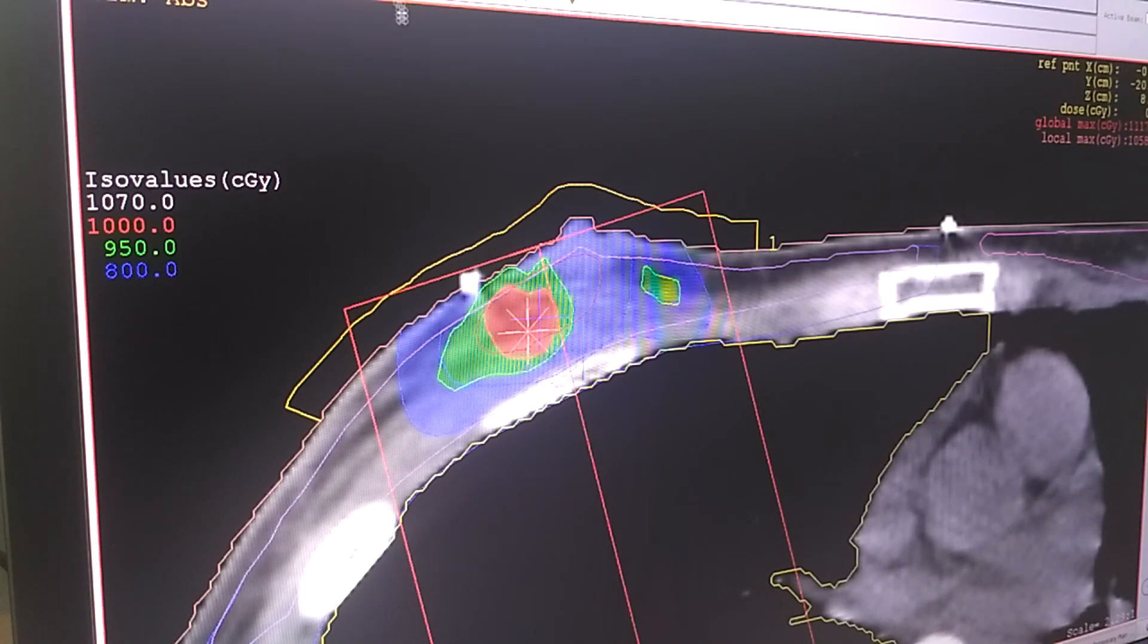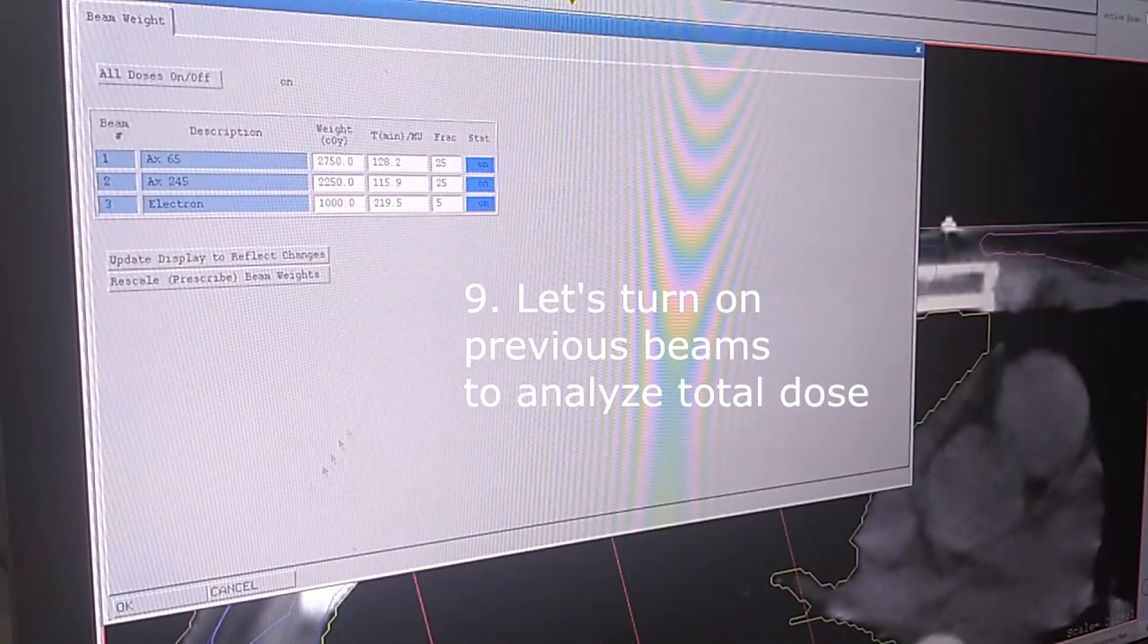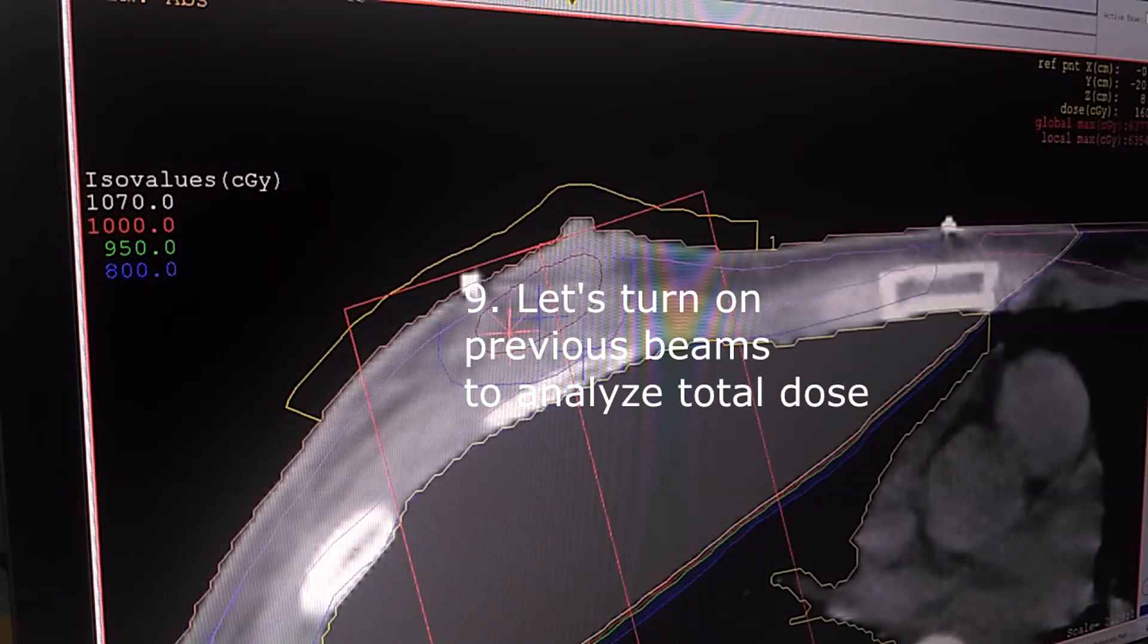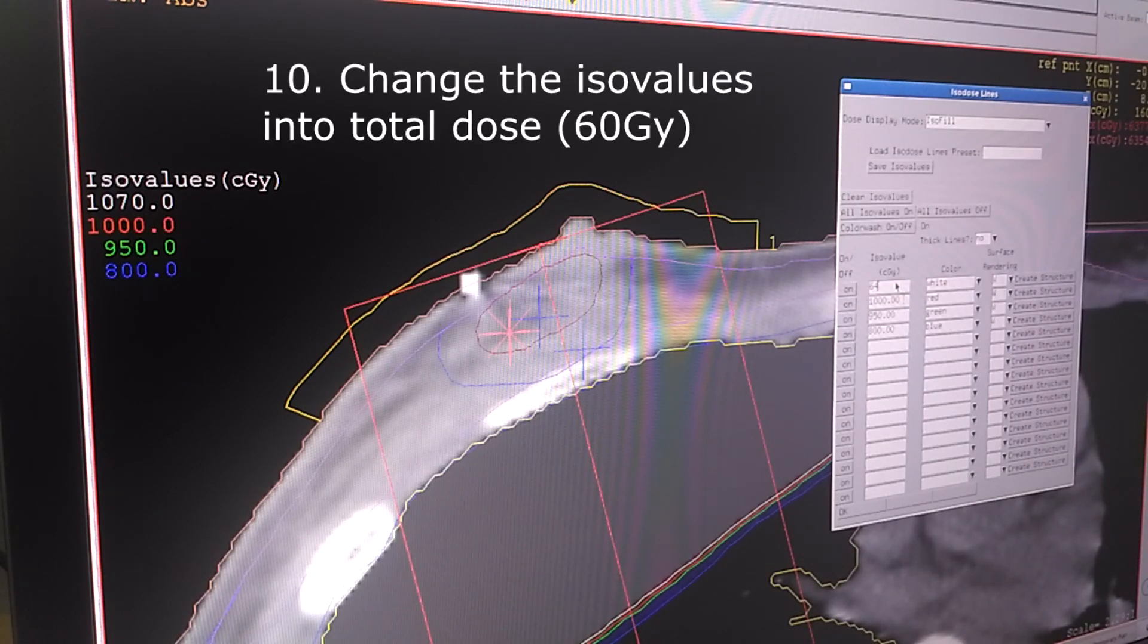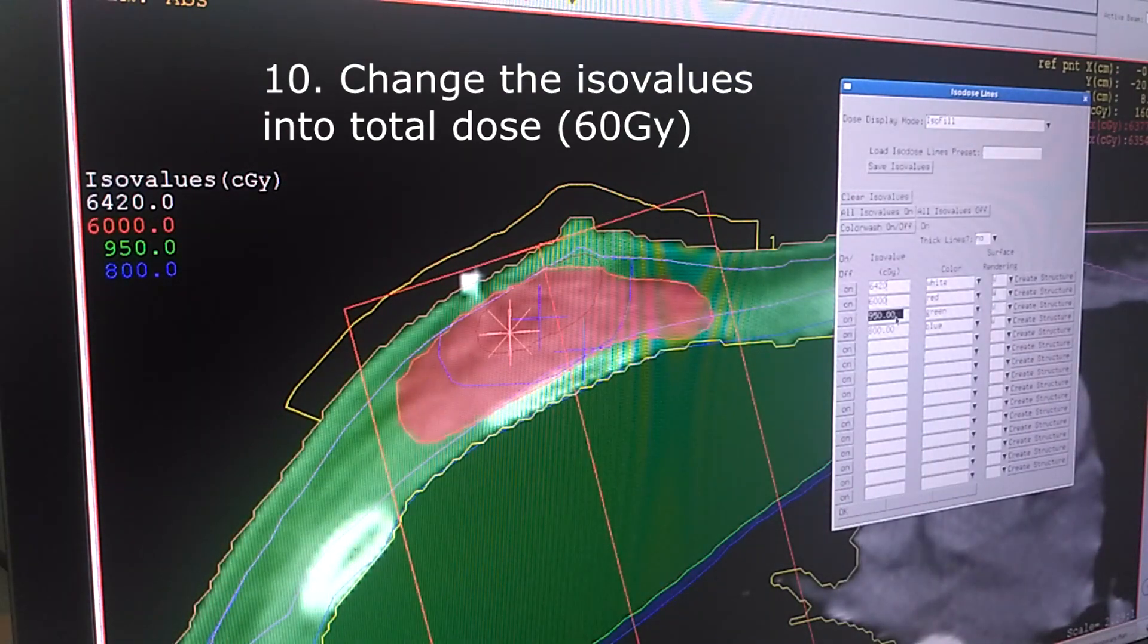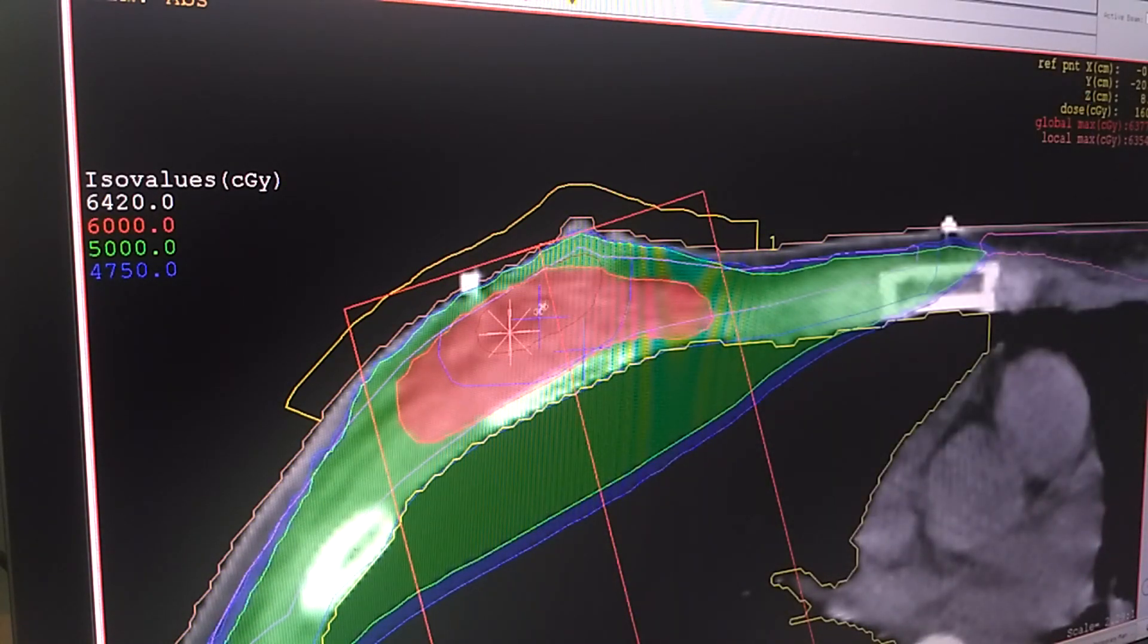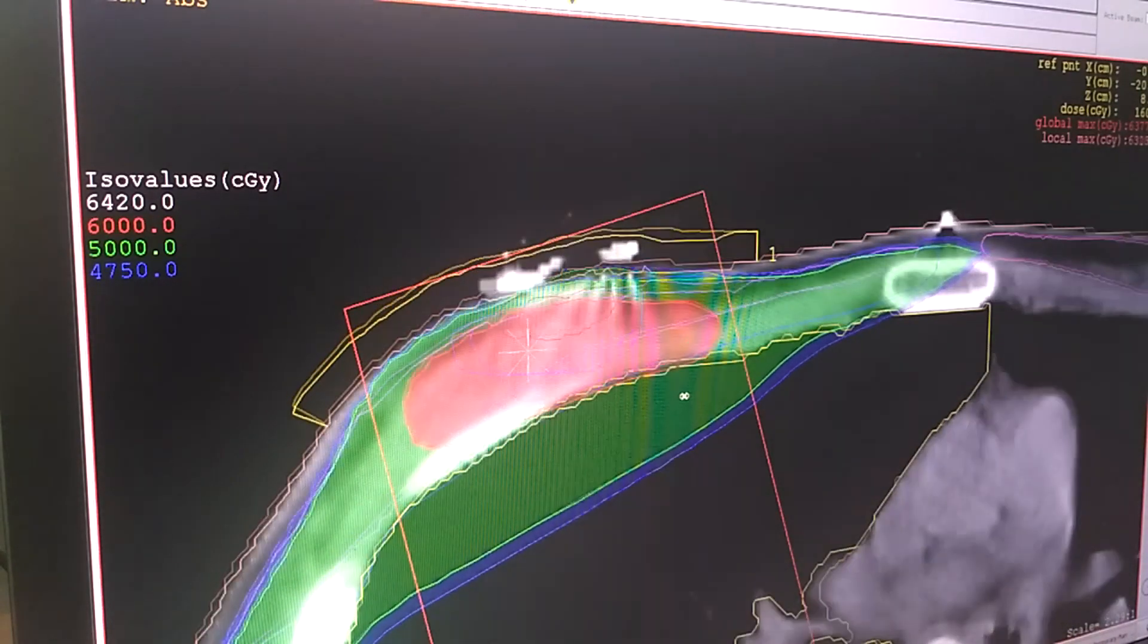And then we're going to analyze it with the previous beam. We're going to turn it on and change the iso value again to 60 gray. Here we can see the 60 gray area and the 50 gray area.